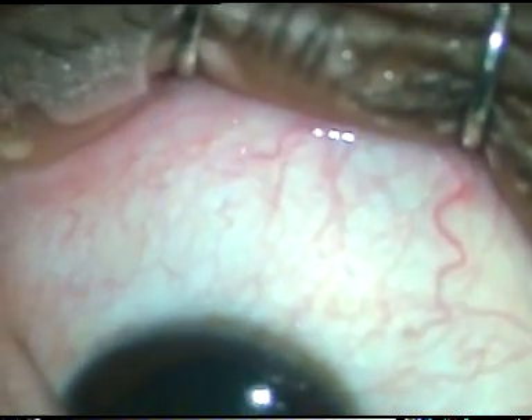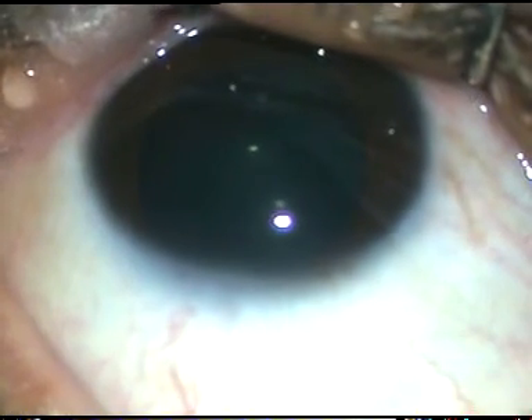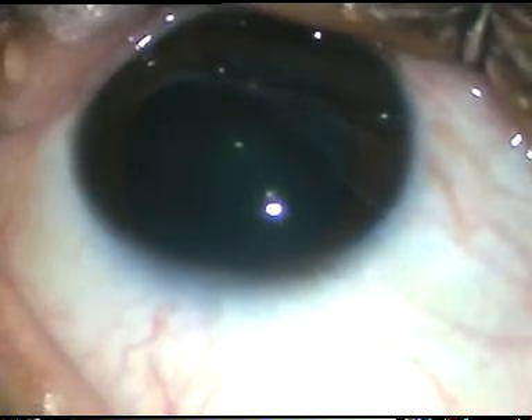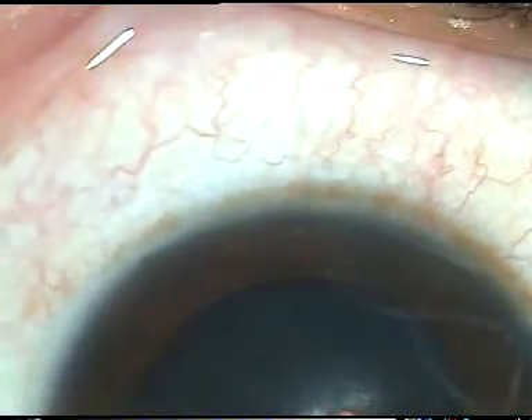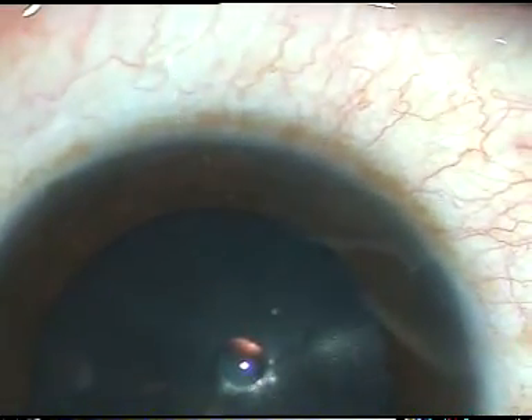And now I am going to inject it. First, the measurement. I am going to use Moxifloxacin. I am at about 3.5 mm away from the limbus, and I am going to mark a spot.